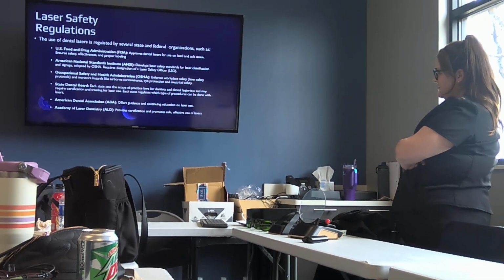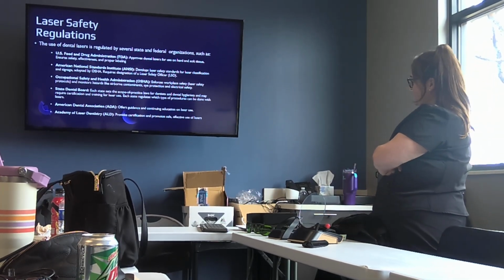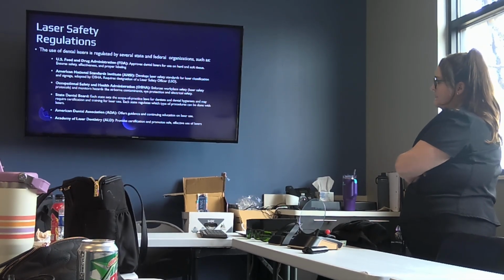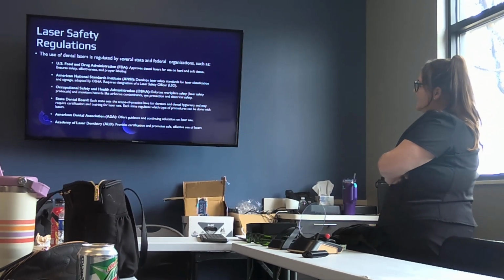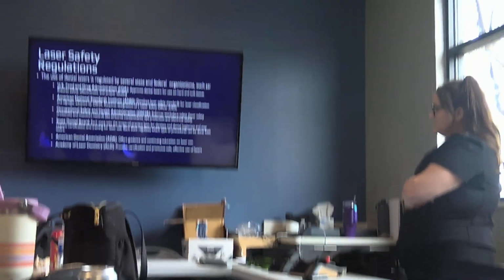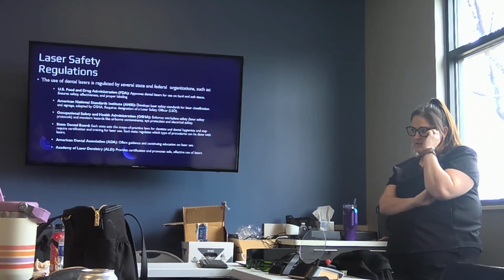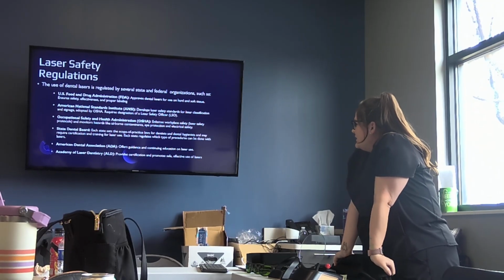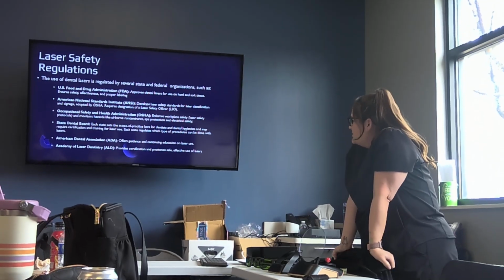The American National Standards Institute, ANSI, develops the laser safety standards for laser classification and signage. And then OSHA adopts those regulations that they set in place. They're also the ones that require the designation of a laser safety officer. So anytime you have a laser in the office, you have to have a laser safety officer. And I'll go into detail about what those do. And then OSHA, of course, we all know what OSHA does.